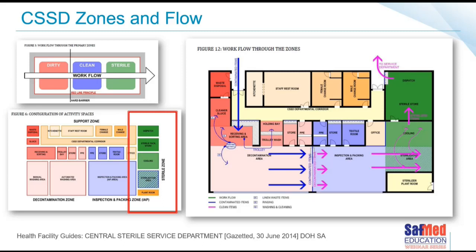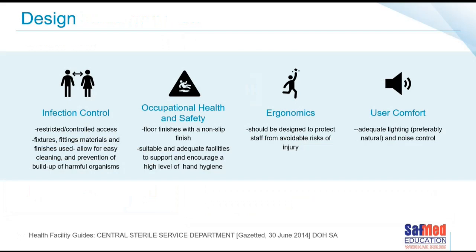Now, sometimes we don't have that privilege. We're not in the middle of a new build, but it doesn't mean we can't still work on getting our principles correct as best we possibly can. We can use logic. We can apply the basic principles to make sure that the flow is correct, and we can do what we can under our given circumstances to make sure that we're doing everything that we should do. And if we use a bit of logic, we can still work through it, even if we don't have the perfect design.